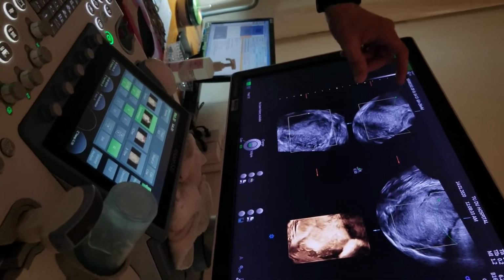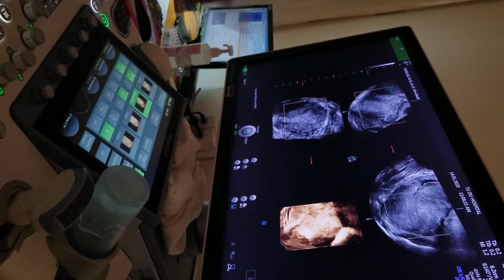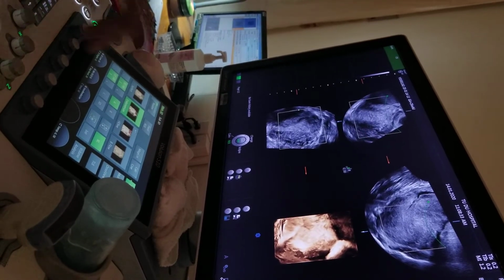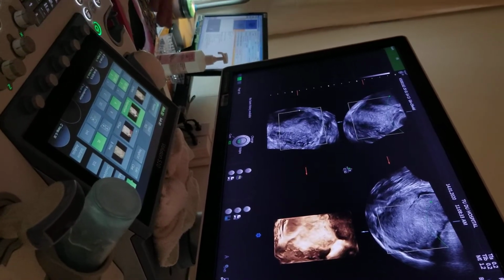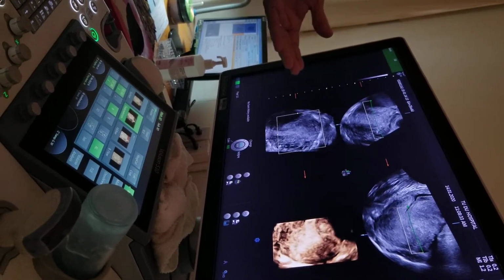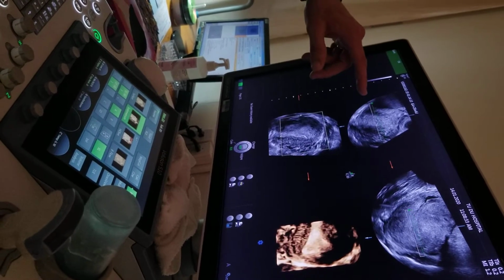So go ahead in A, and you make it very, very tiny, right over the. So you change right here. You see? Change the size. Okay. Small. Smaller. Okay, right there.